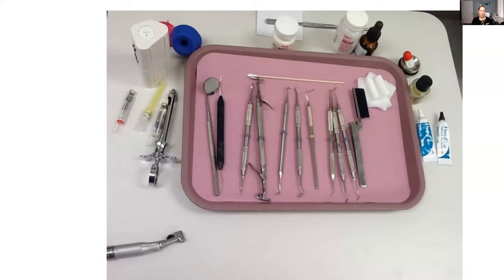The Dical would be used before the IRM as a liner, to really seal up that prepped area, and then the IRM would be placed over top. Sometimes a liner isn't used, sometimes it is. Copalite is kind of the same — you might use that under the IRM or under the amalgam. It's hard to say, so that's why they have that set up here.